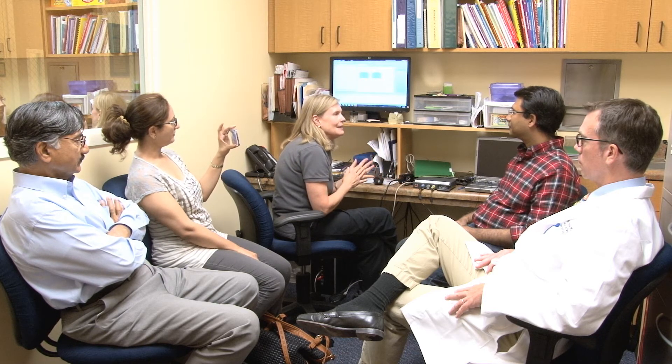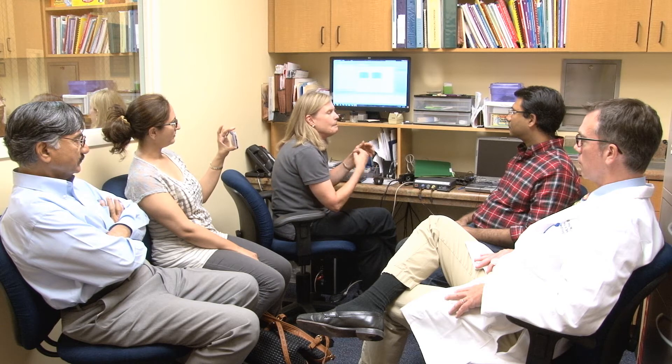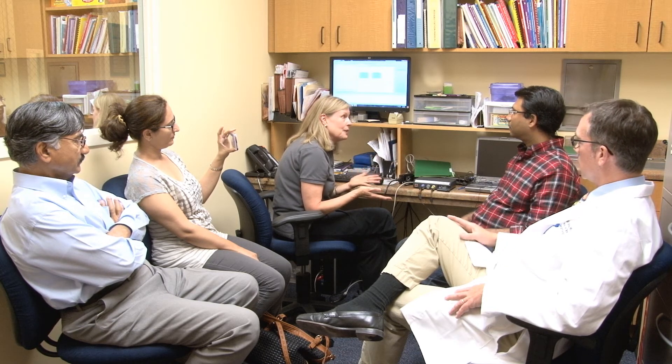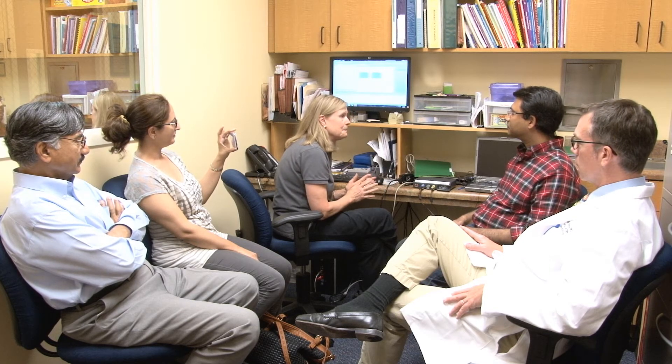What we can do over time is make you different programs. For example, if you like to listen to music — of course you're going to be listening with your good ear, but you can also listen with your implant. We might need to make a map that has more bass emphasis or more mid-frequency emphasis to make music the most enjoyable. Do you have anything with you to listen to music? I have it on a USB. Okay, you can play that on the computer. So we can make a map specially for music, and a map that's better for listening in noise. We'll just try some different things — it's going to be interesting for me too.